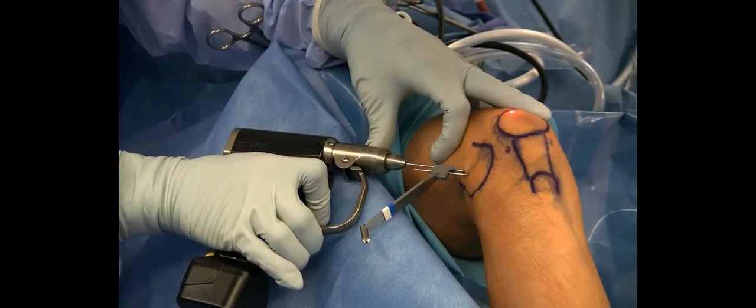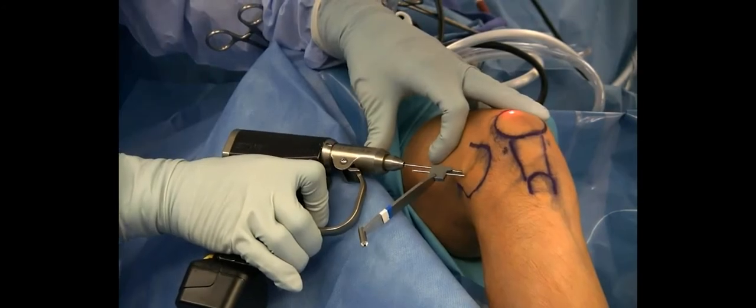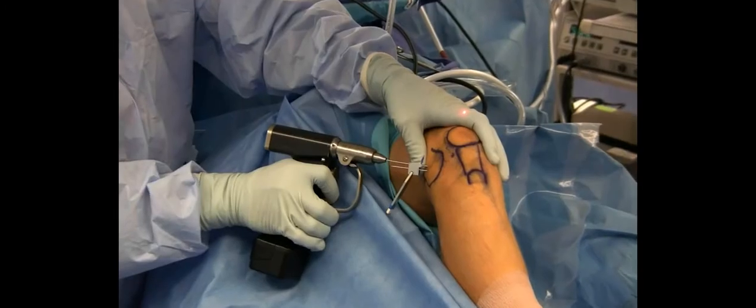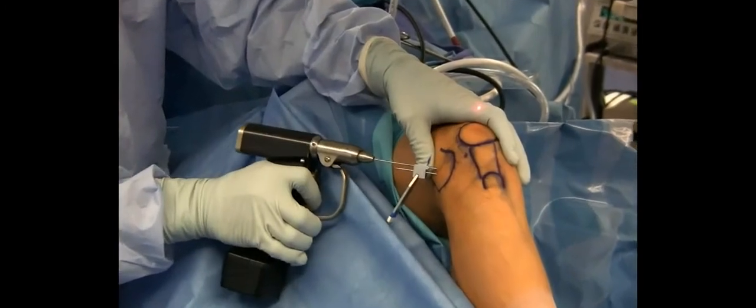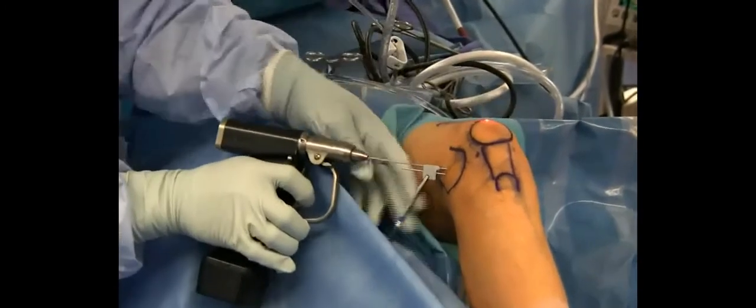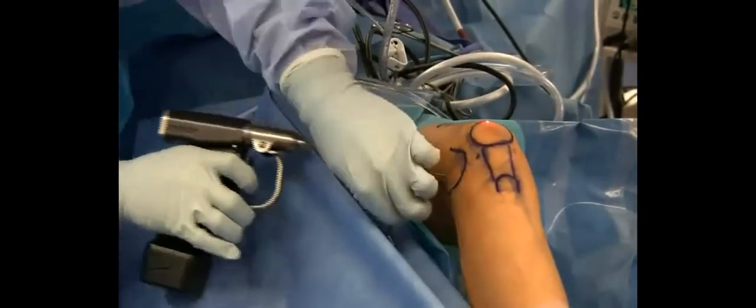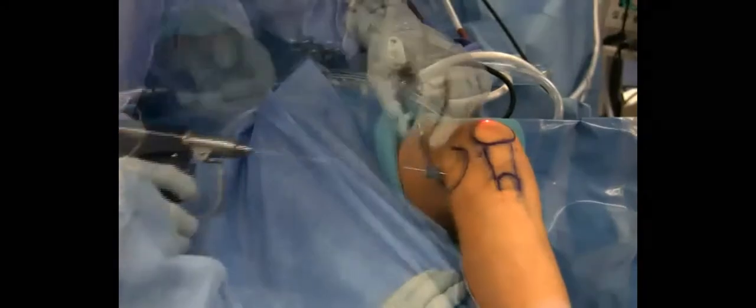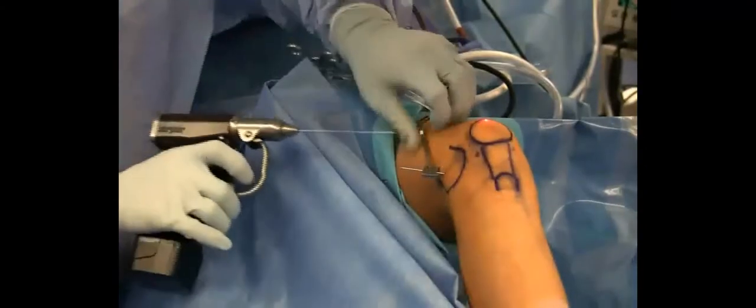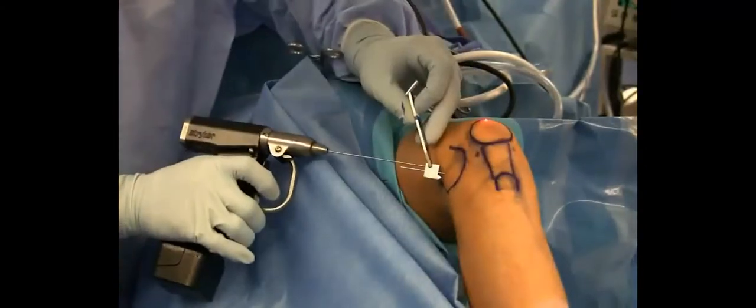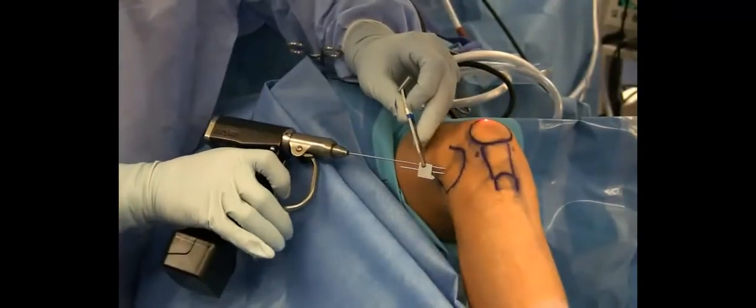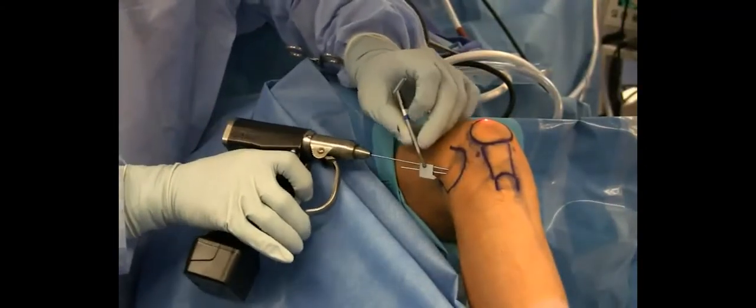Here we are with the K wire advanced to the sclerotic rim. We then advance the K wire through the sclerotic rim and into the subchondral bone. We then use the offset guide to circumferentially drill around the first wire.